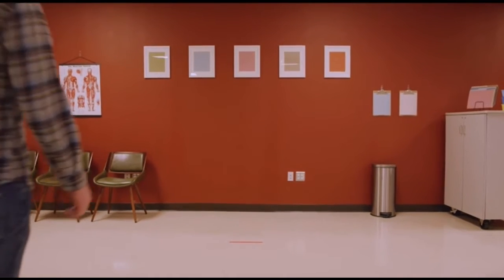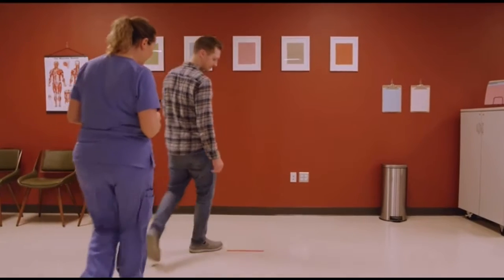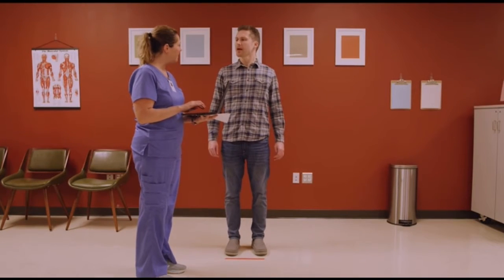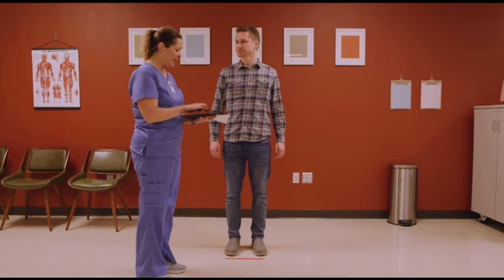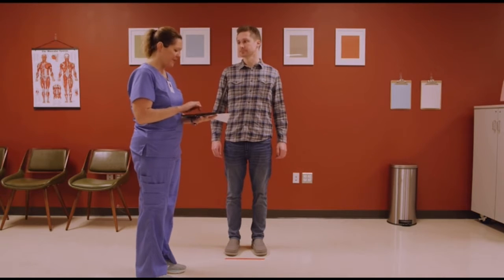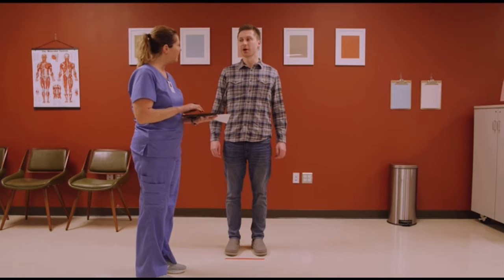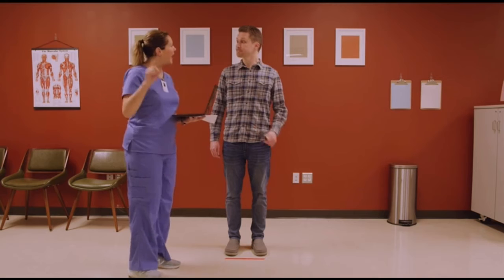Direct the patient to stand on a mark on the floor that's 20 feet from the Snellen chart. To properly administer a visual acuity screening, you need to ask the patient if they wear corrective lenses or contacts, and when they last saw an eye specialist. Record the date of the patient's last eye exam. Hold the occluder by the handle and don't touch any portion of it that will touch the patient's eye. Pass it to the patient.